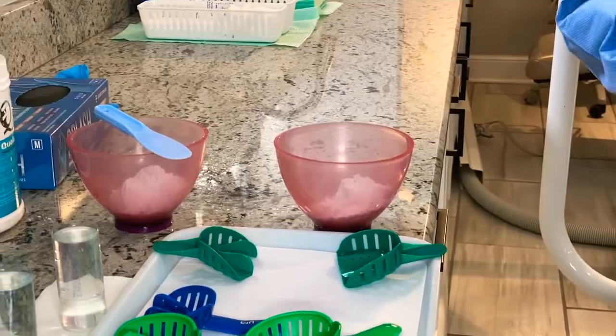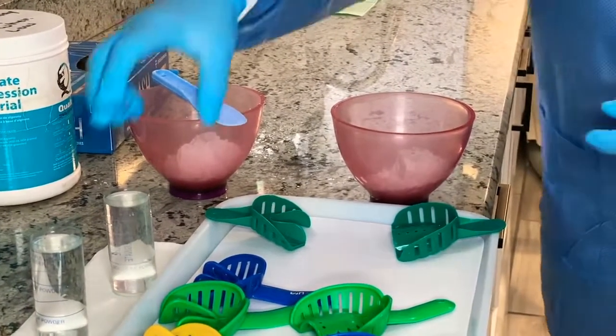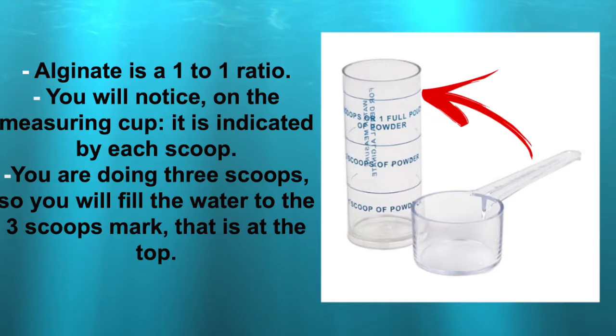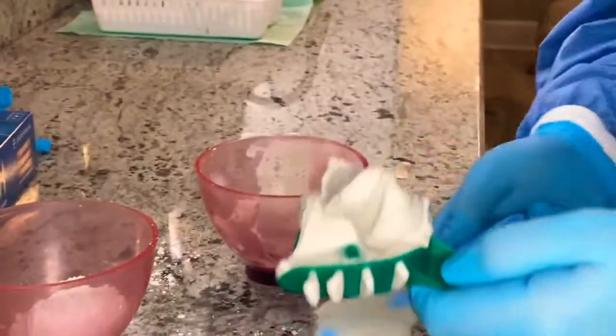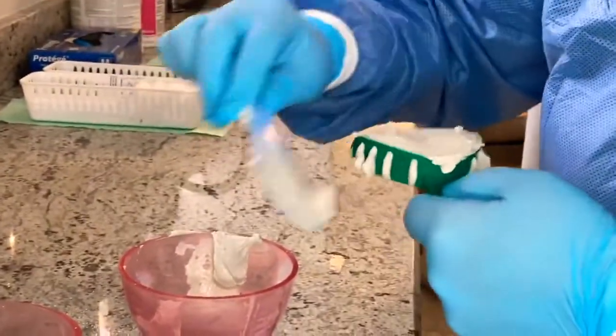I'm going to take the upper first. The upper impression is taken from behind the patient, so I'm going to mix the alginate and then place the tray. Take the water into the alginate, hold on to the bottom of the bowl, and mix it — mix it in the middle, try not to make too much of a mess. Go back and forth to incorporate all the water into the powder. Use your bowl — your bowl is your friend. Once it's all smooth and ready, scoop out as much as you can, put it into your tray, and spread it to the sides just a little bit.